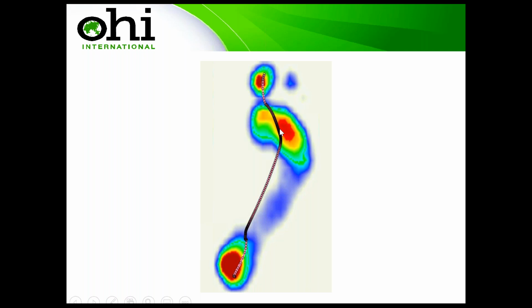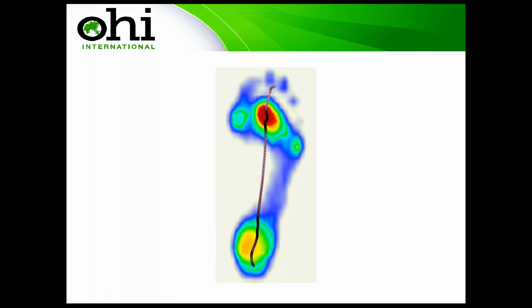Why, with rotation off the second, third, and fourth metatarsals, is that going to cause an impingement? Is that going to cause a neurological impingement, a Morton's neuroma, or a plantar digital neuritis? Moving down, we have a foot which is externally rotating and rolling laterally. So if we use that example, you could have a foot which is definitely going to be laterally unstable, which is odd to see, because a lot of these patients, when you see them standing, are going to be very flat-footed, very mobile, very flat-footed. And it's odd to think of them as somebody who's very laterally unstable.